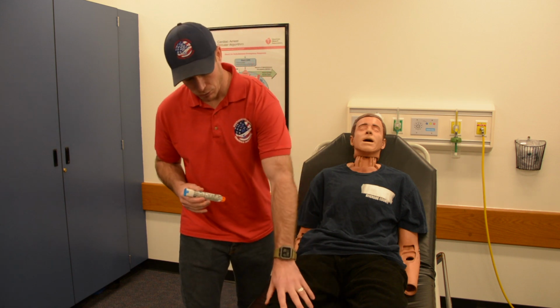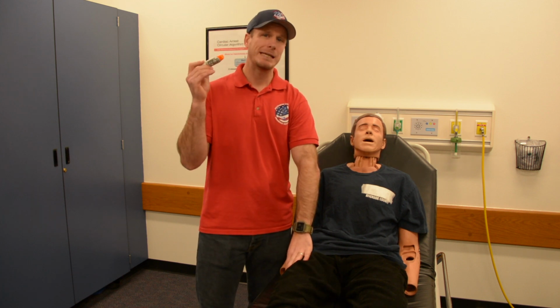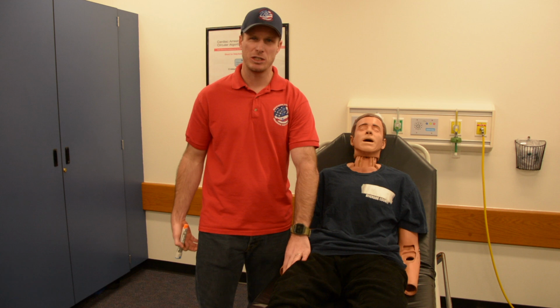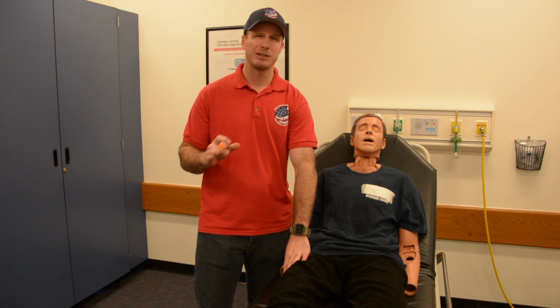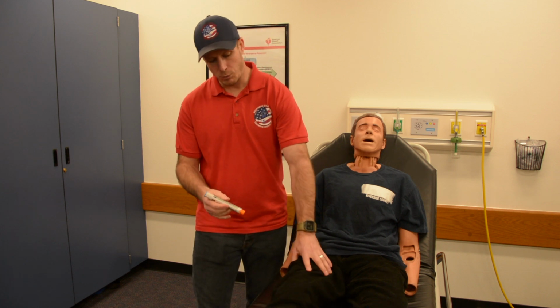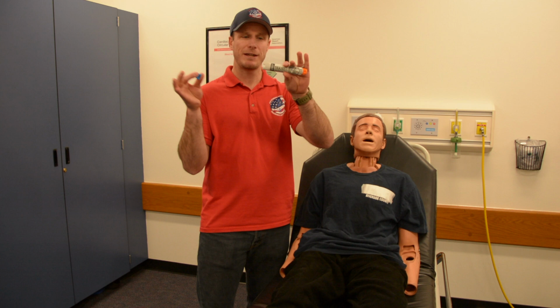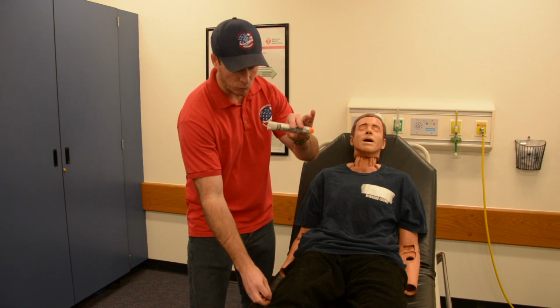After that, we're going to make sure we can either expose the outer portion of my patient's thigh, but your EpiPen can go through looser clothes if they have jeans or something on. Make sure there's nothing in their pockets, because you don't want to go through a pocket and hit something in their pocket. We're going to find the outer part of the patient's thigh. We're going to go ahead and pull off our safety cap. The safety cap is typically in the rear.